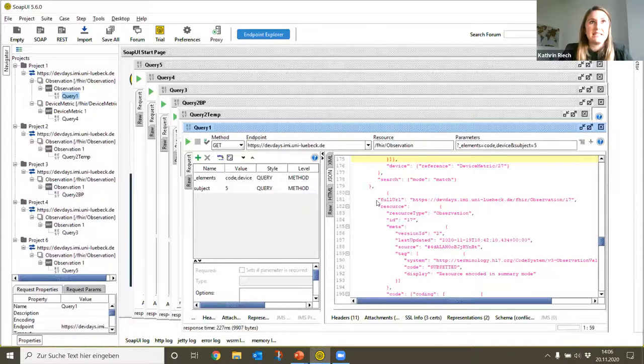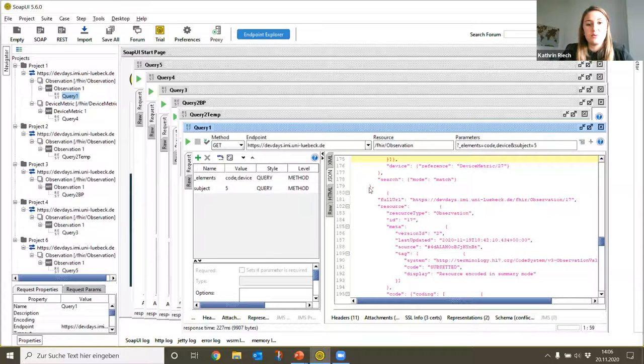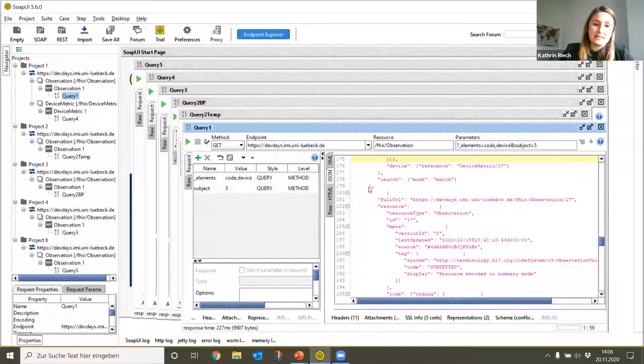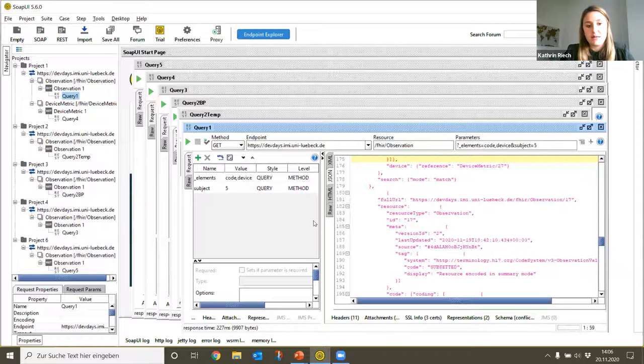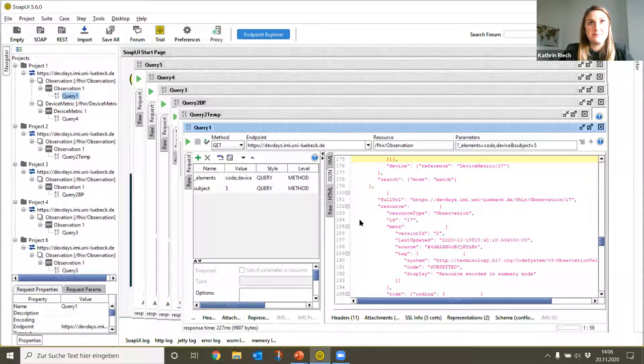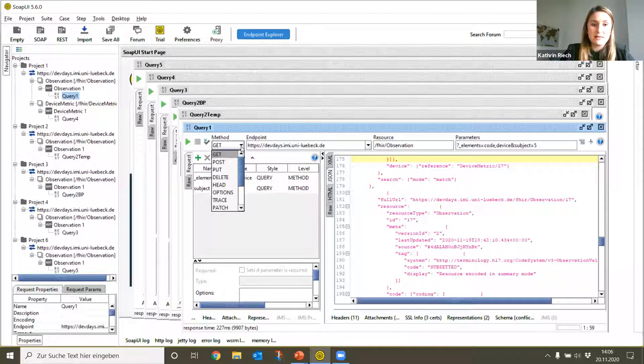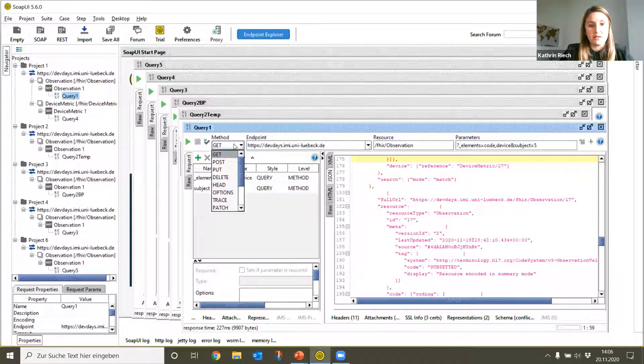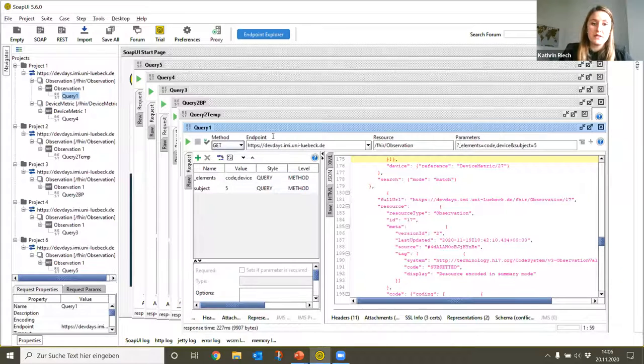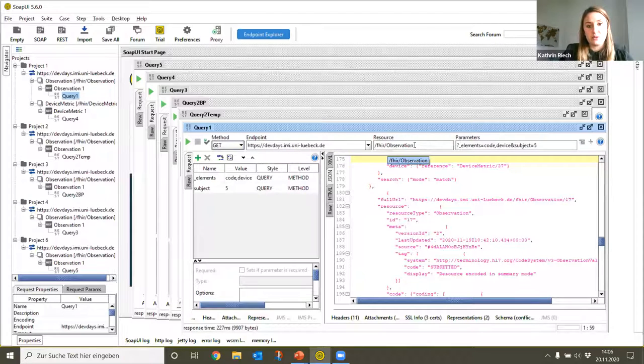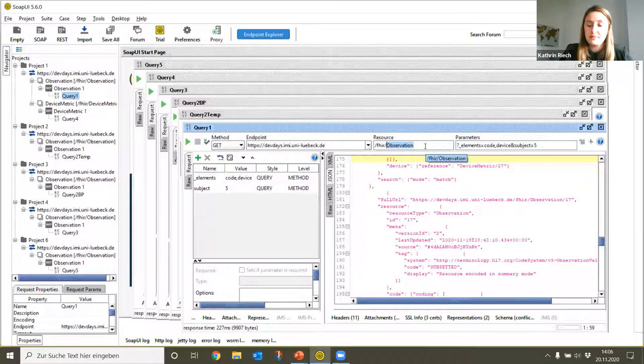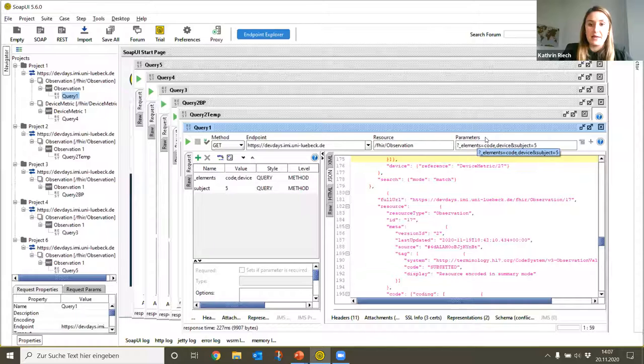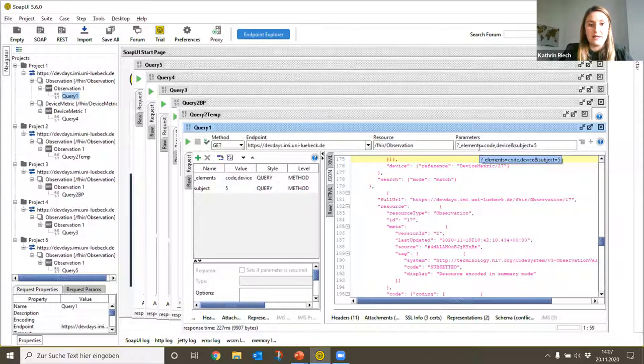Here you can see the SOAP UI interface we are using to perform our queries. The advantage of SOAP UI is that you can save your queries, but you don't need SOAP UI. When you're working for example with a HAPI FHIR server, you can as well use the HAPI FHIR client environment. At the beginning when we want to start a query, we need to choose a REST method. In our use cases we want to retrieve data, so we're using the GET method. Afterwards we need to specify the endpoint of our server and the FHIR resource on which we want to perform our queries, here for example the Observation resource. Finally, at the end we can specify our search parameters. These four fields together are building the query.